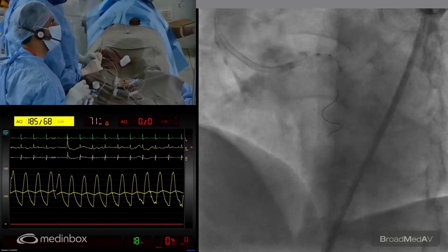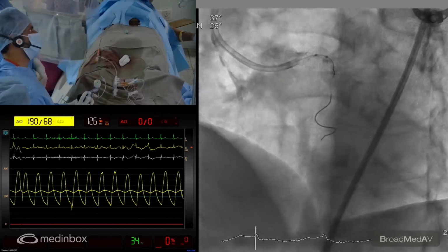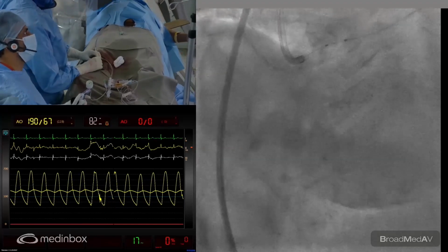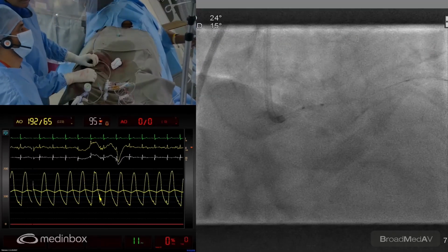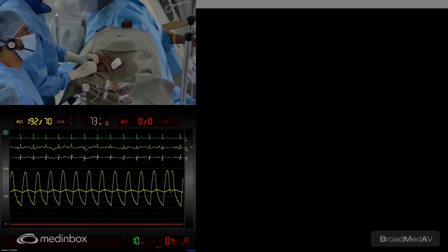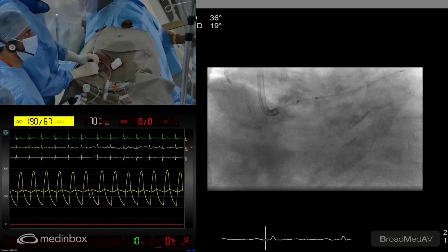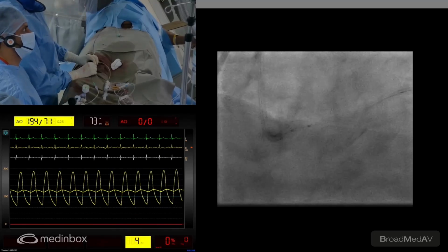So we are now in the distal area. We're just slowly getting that down. Okay, I'm going to do a cine to see whether we are inside the stent. Difficult to make out, but come to the RAO caudal. And I need the stent boost here, please. Please get a stent boost down. Yeah. We are outside the stent, so we need to come back.